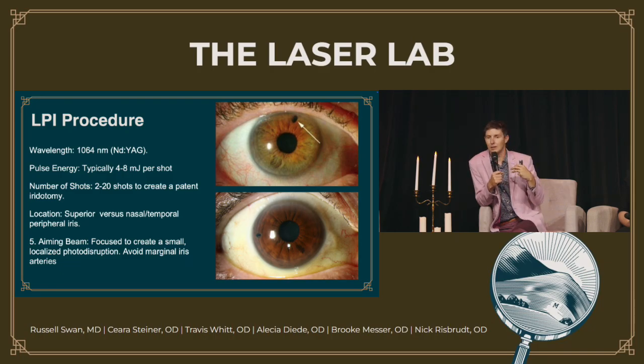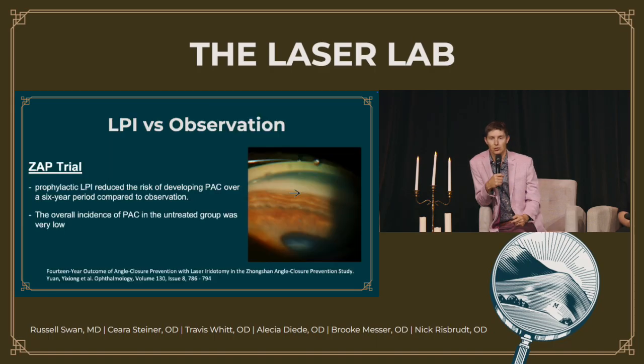So that's the one spot where you might say, well, why in the heck did Alicia Russell put an inferior PI on this patient? That doesn't make any sense. They definitely didn't tell us to do it there. That's usually the case, that it's a patient that's had a partial thickness cornea transplant.